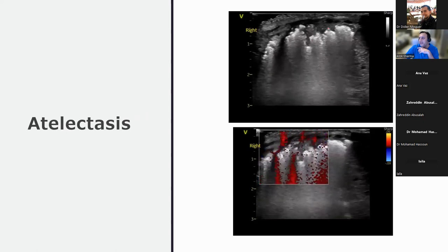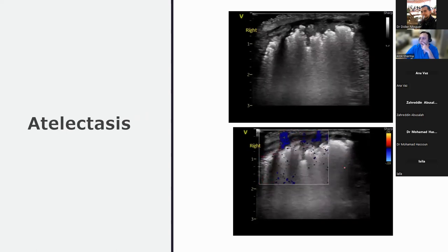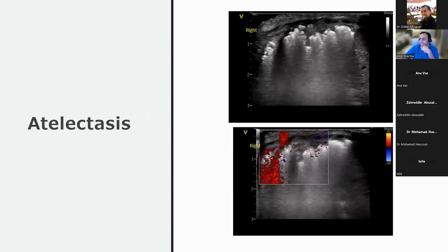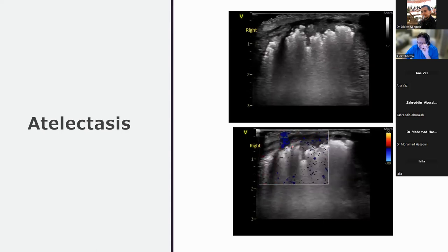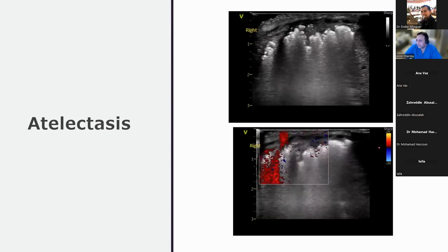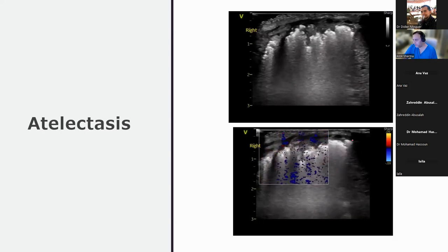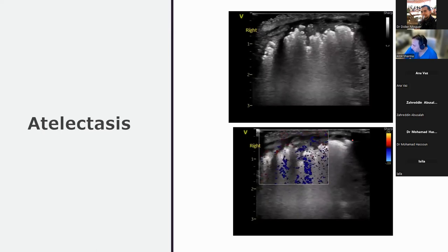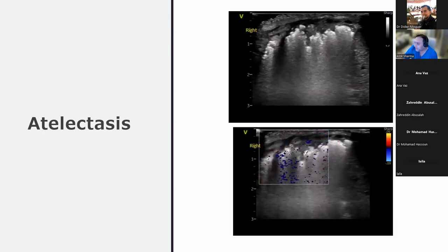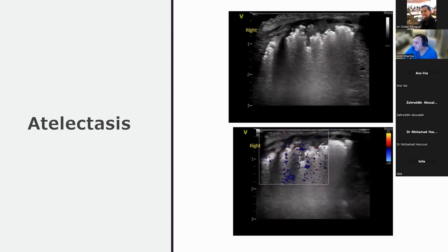Now, this gets really confusing because this could be a shred sign. But I have no pleural margin here. And can you see when I put Doppler, do I have any blood vessels? Yes, there are some blood vessels. So is there a typical kind of flow or is it just a diffuse kind of speckly pattern? No, it's diffuse. Yeah. So this is where I would say be very careful. When you put Doppler on, really what you should be able to see is a blood vessel-like arrangement. This is just Doppler, and really it's a speckled pattern without any particular blood vessel kind of pattern.